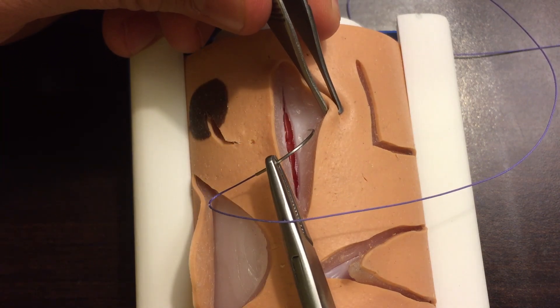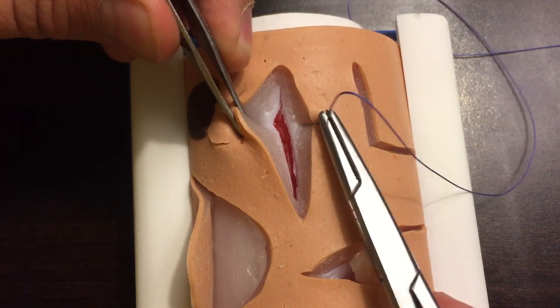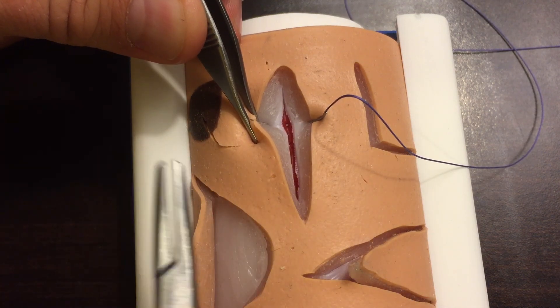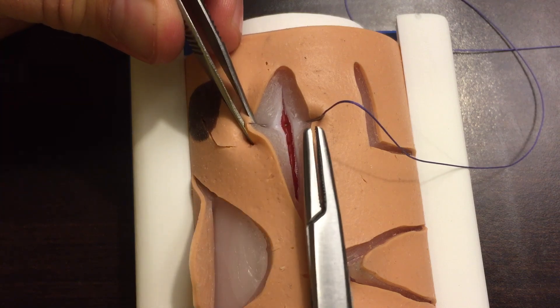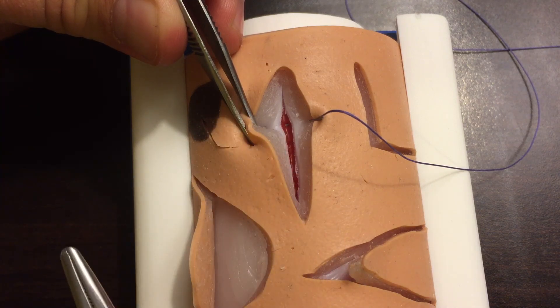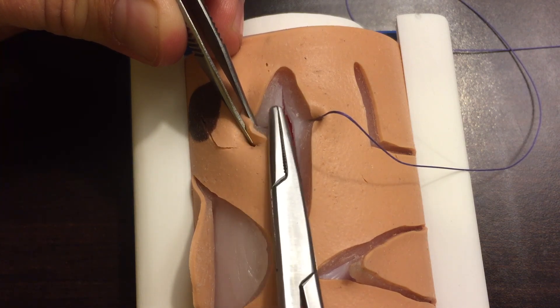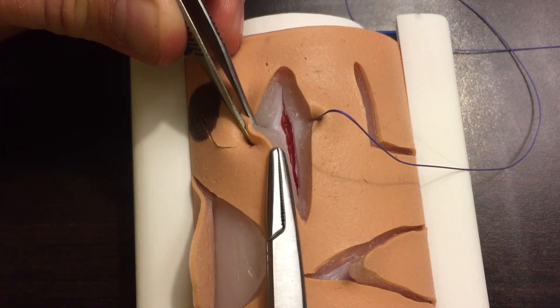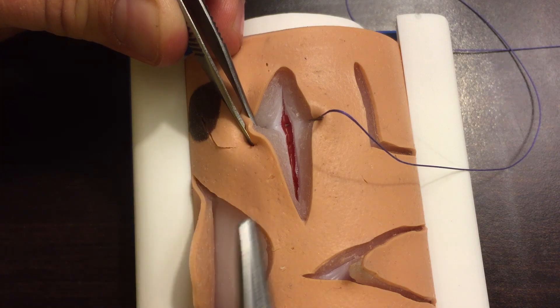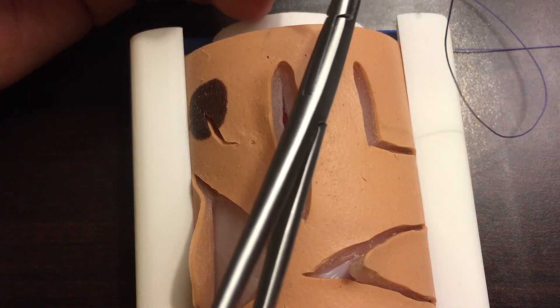I wanted to point out a couple of things. This can be done in a way similar to a simple interrupted — you might come here, take a bite, then reach across, grab the fascia, take another bite, exit, pull it through, and do your tie. That would be just fine. The only concern you really need to think about is if the subcutaneous tissue and skin is not very thick — if your vicryl knot is on top of the fascia and this tissue is not very thick, you might be running the risk of having your vicryl knot get in the way of your healing skin.